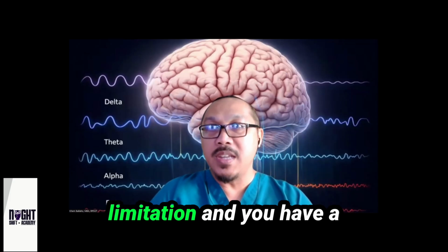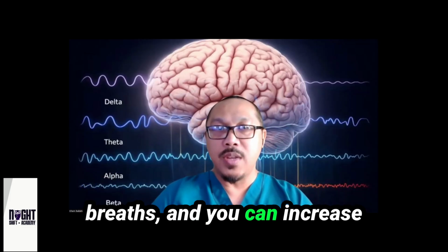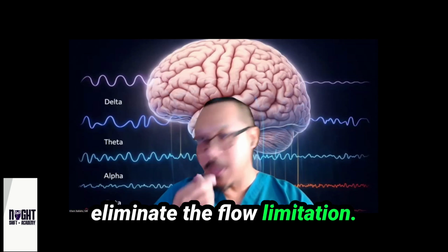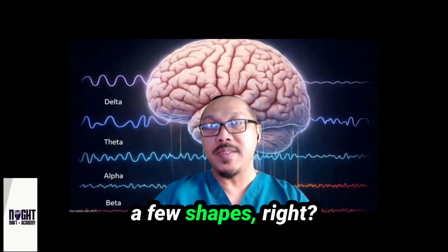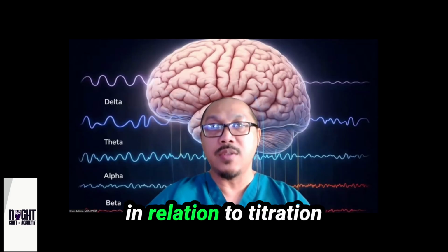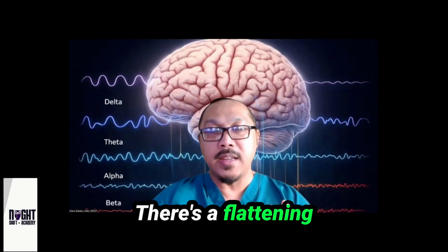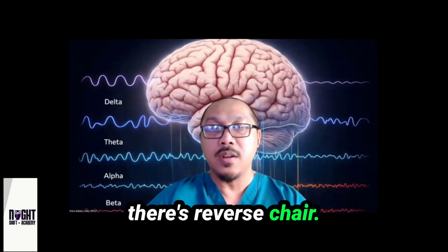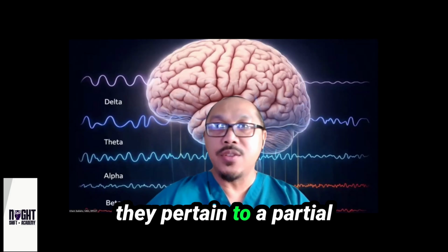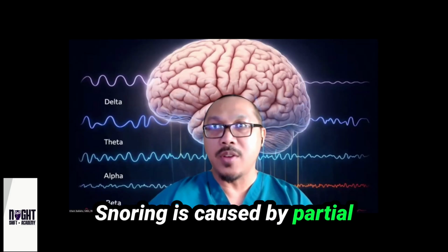Sometimes if you see flow limitation and you have pretty long flow limited breaths, you can increase pressure to just see if it does eliminate the flow limitation. And flow limitation has a few shapes, right? I do have some other lectures on flow limitation, particularly in relation to titration, because flow limitation is not all the same. Okay, there's a flattening flow limitation, there's M shape, there's reverse chair. And so these flow limited breaths pertain to a partial airway collapse, very similar to the snoring. Snoring is caused by partial airway collapse, right?